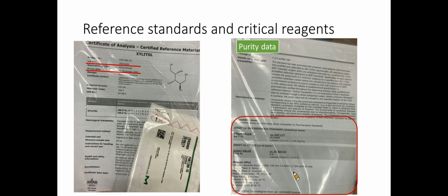However, when this scenario is not possible, you can use an established chemical form, such as a free base, free acid, or salt of known purity. You should provide the certificate of analysis, including the source, the lot number, and expiration date for commercially available reference standards.